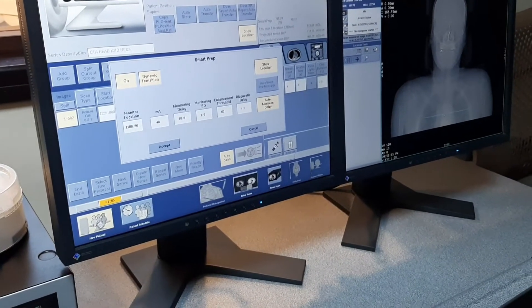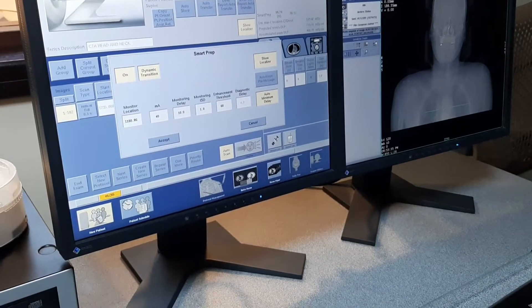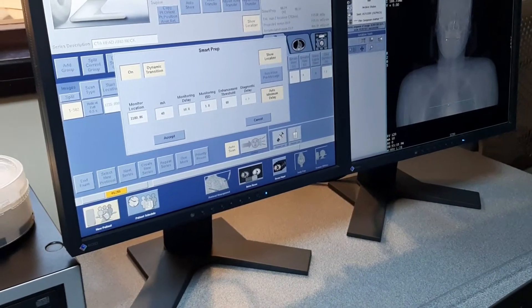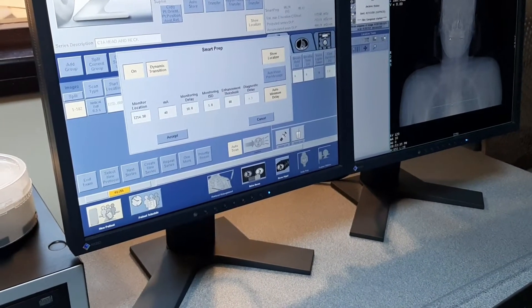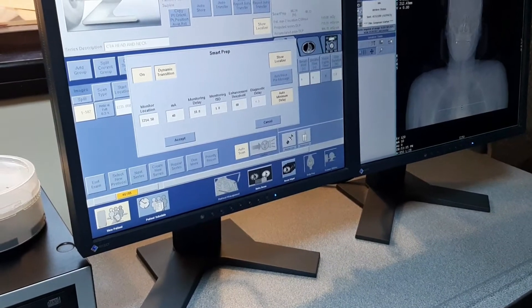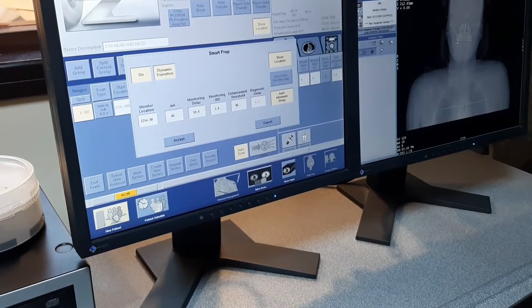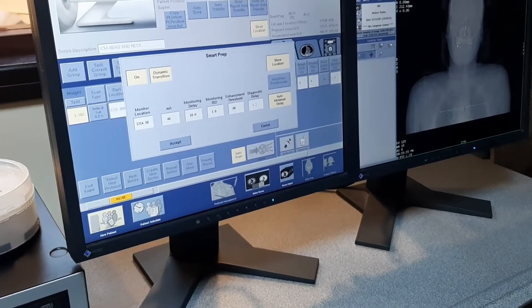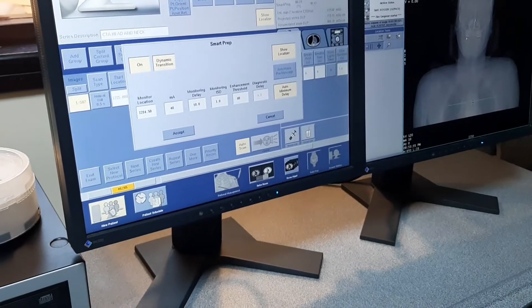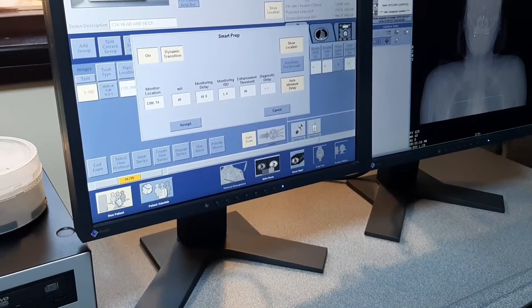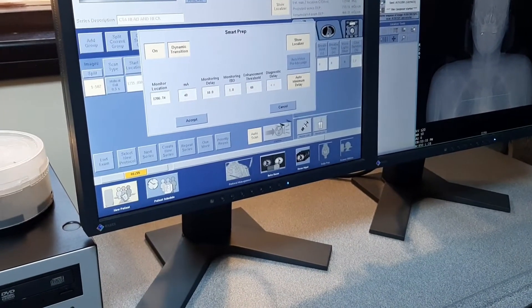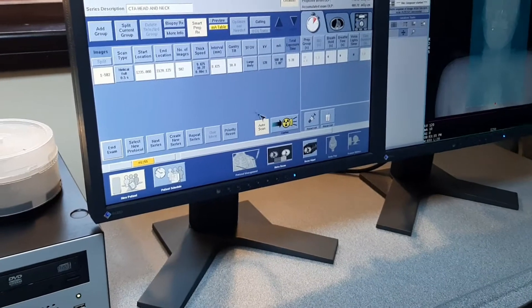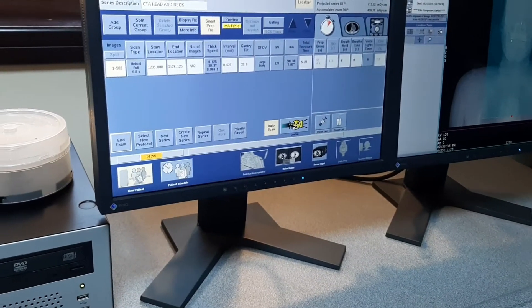No, go more up — these aortic arches, more up, more up. Yeah, this is the aortic arch halo. Now accept. Now you're ready. The scout is done.